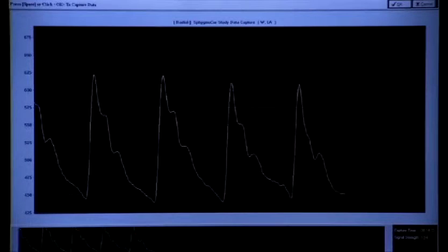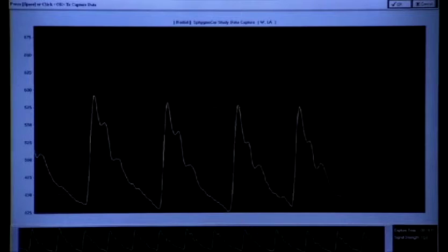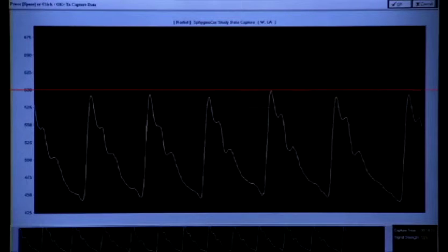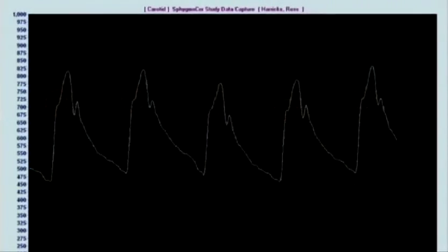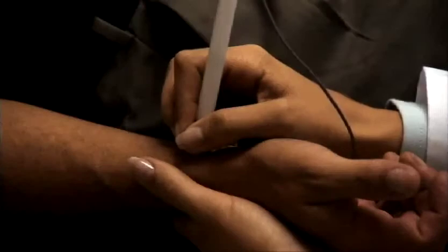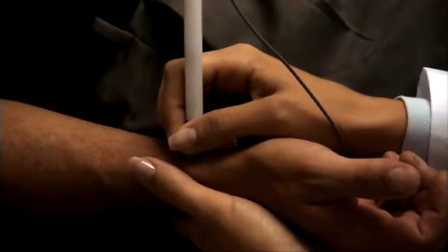The goal in pulse wave analysis is to record about 10 seconds of consistent, continuous blood pressure waveforms, which takes 2 sweeps of the computer screen. The waveforms should be tall, filling at least half the screen. They should be of consistent height. The peak of each wave should be near the same vertical position on the screen. Each waveform should have a sharp upstroke, from the onset of the pulse to the peak of the wave. If you see a curve in the upstroke of the wave, this is artifact, which can be removed by slightly re-angling the position of the tonometer.